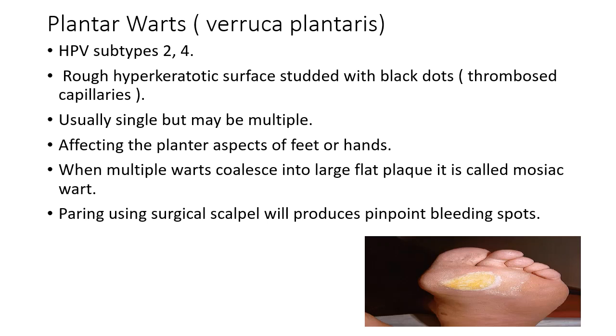Coming to the histologic features of verruca plantaris, they are more or less similar to verruca vulgaris. Clinical distinction is mainly based on the location, and they are mainly endophytic growths. A greater proportion of the lesion lies beneath the plane of the epidermis. As you can see from the pictures, mainly hyperkeratosis, there is papillomatosis, and along with it you can see the keratohyalin granules and the coilocytes.